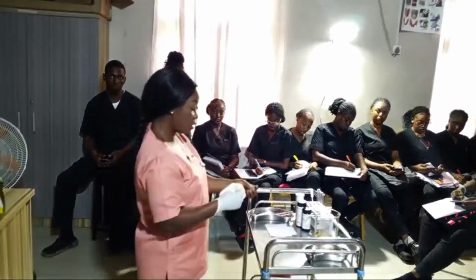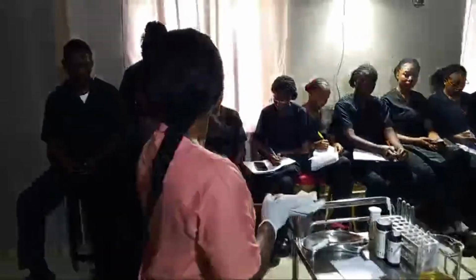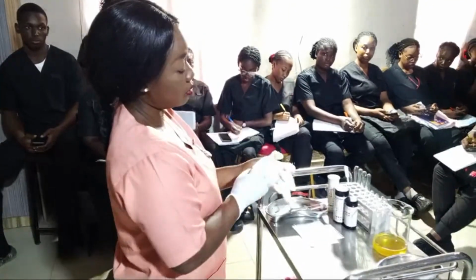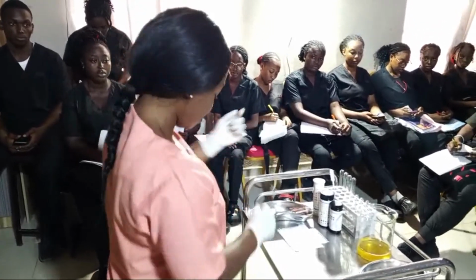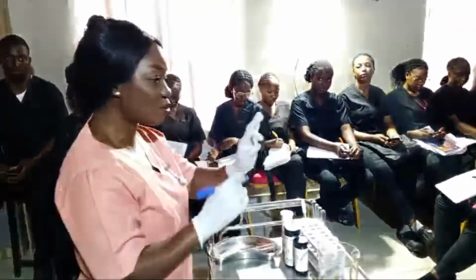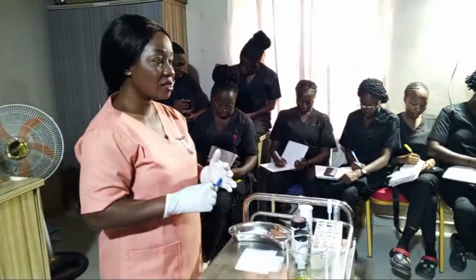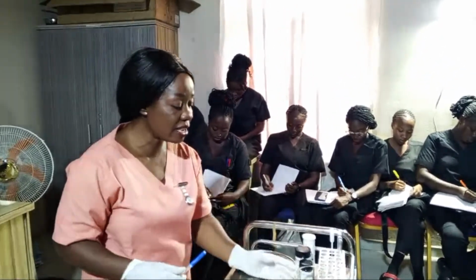We can come close. You must have your pen ready to write. So the first urine testing is divided into two basic headings. That is the physical assessment and the chemical, right? So you have to physically examine the urine.